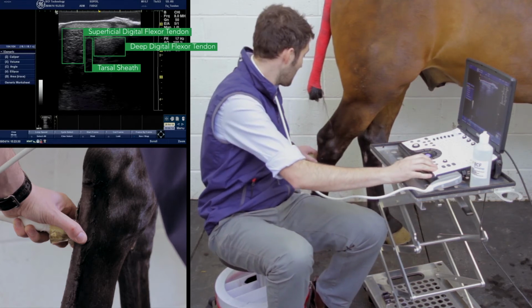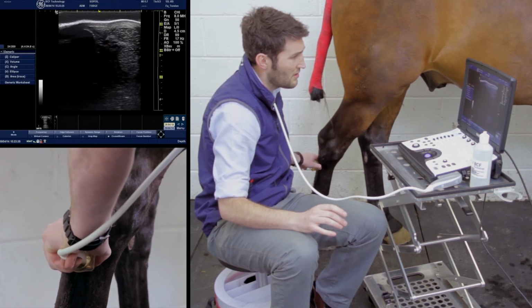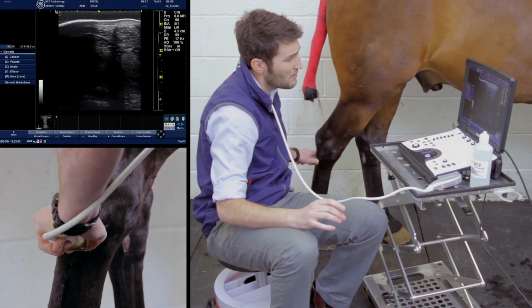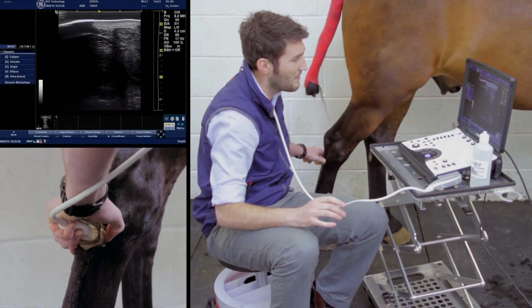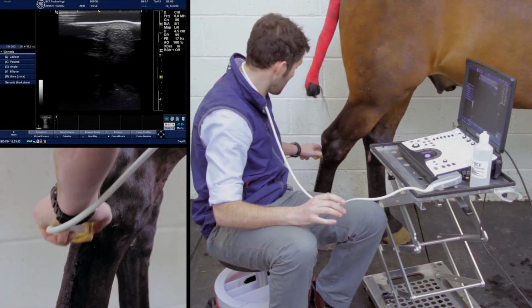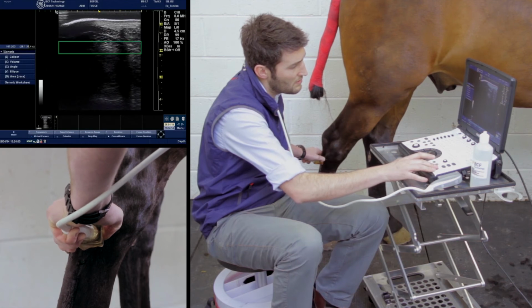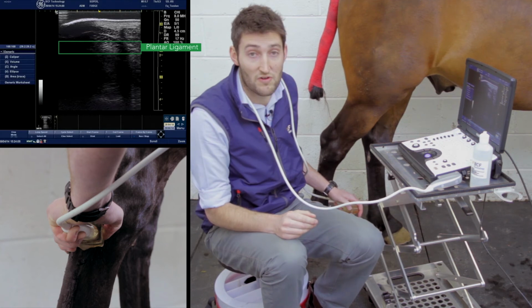And then unfreezing that, we come laterally. And we can get the fibres of the plantar ligament then on the lateral aspect of the leg.